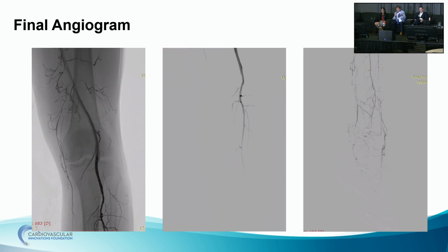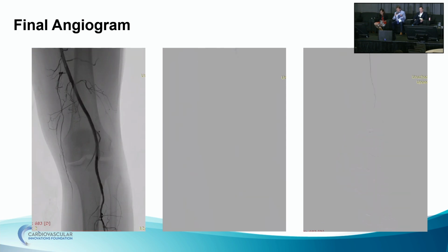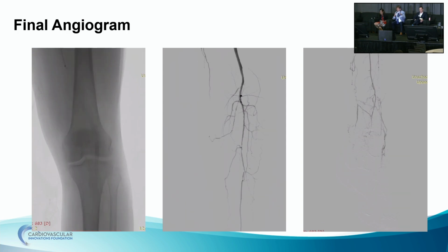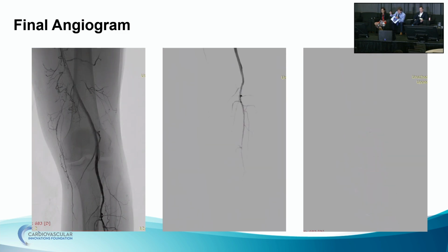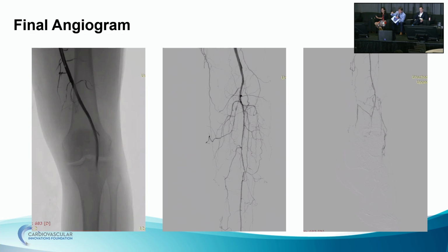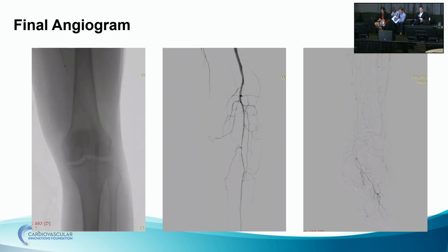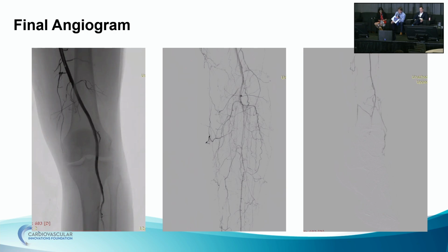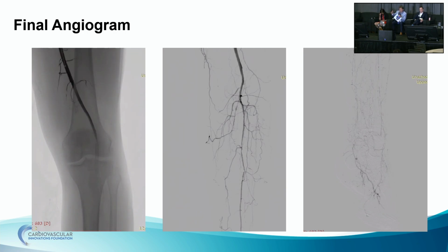If you're going to put a Supera and distal to that put a drug-eluting stent, you must do it in the order that you did it. In other words, you've got to put the Supera in first and then add the drug-eluting stent. Why? Remember, the mechanism of delivery of a Supera is that nose cone ratchet over, gets sent forward. It will mangle a little 035, or excuse me, a coronary stent. So the way you did it, Herb, was spot on.